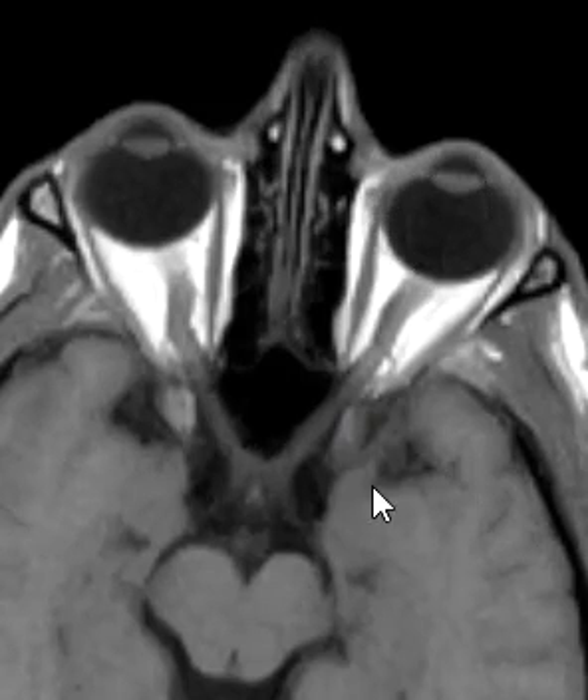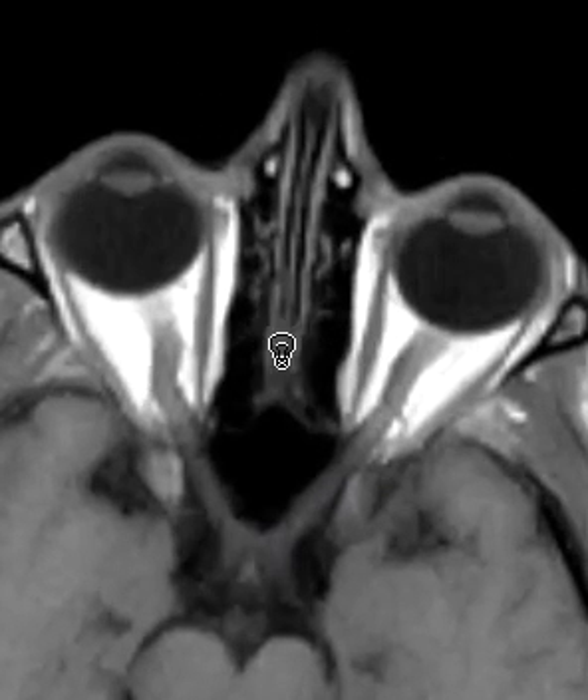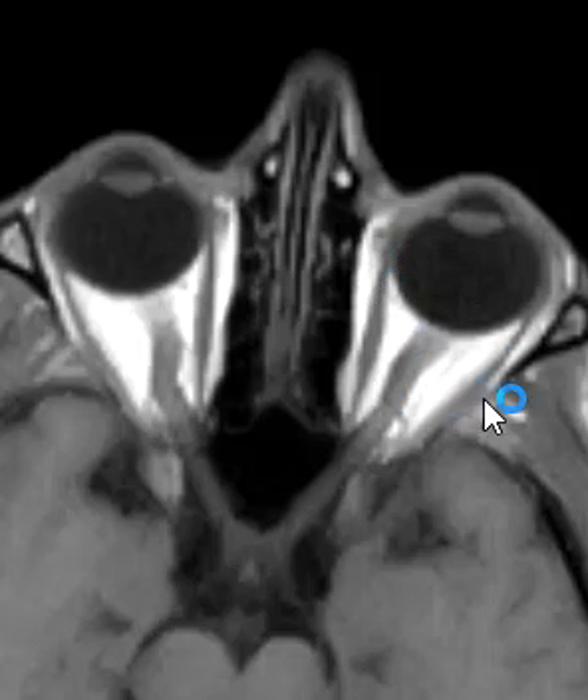This is your left eyeball. The eyeball has this fluid signal centrally, and on this sequence fluid is dark and fat is really bright. So here's orbital fat in the orbit, here's the dark fluid within the eyeball, and this little thing here that's a little bit brighter — this is the lens. You can see the lens on the right side and the lens on the left side.